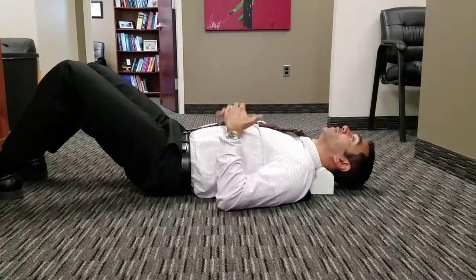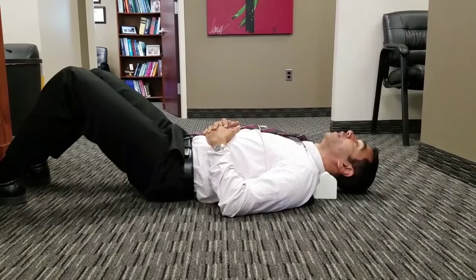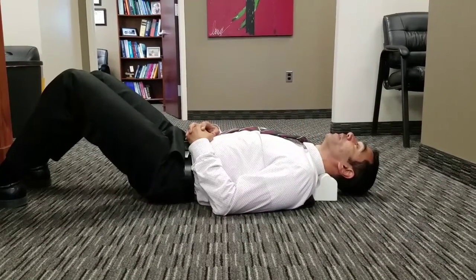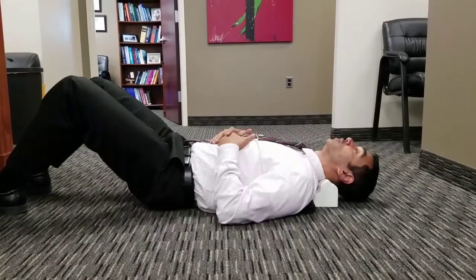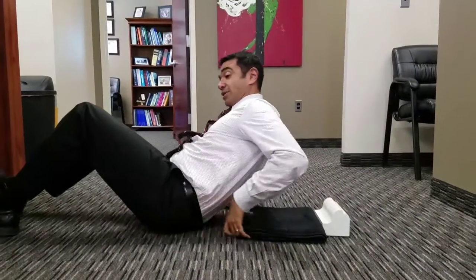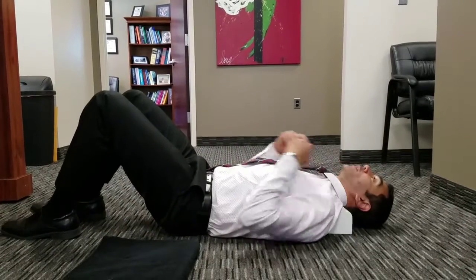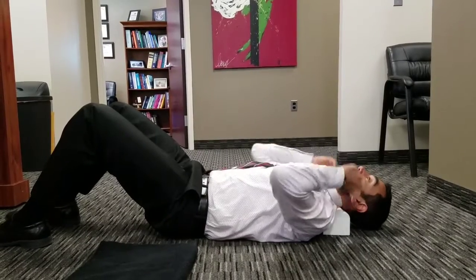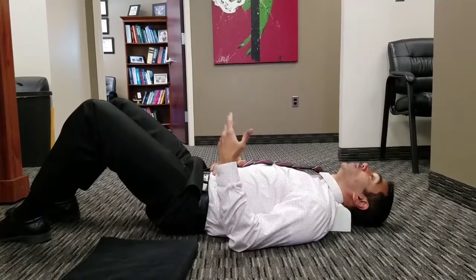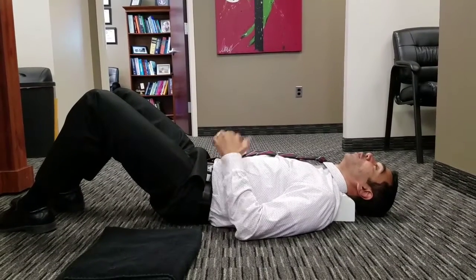So for me, this doesn't feel like much of a stretch, but for some of you it would be. But you can see it raises my shoulders and my upper back up just enough so that this doesn't seem like it's pushing so hard. Without it, as you saw earlier in the video, it would look like this, and it seems like a much higher push. So you can use the towel, fold it up as much as you need to, and start with that. Hopefully that helps you.